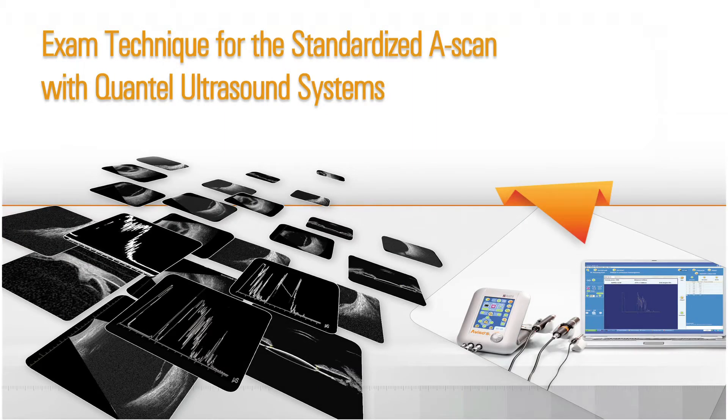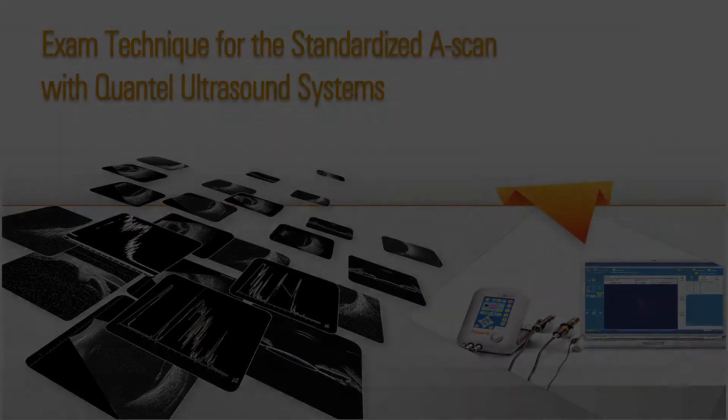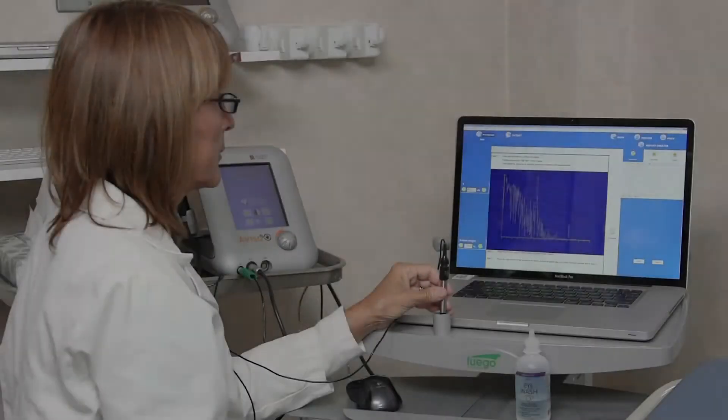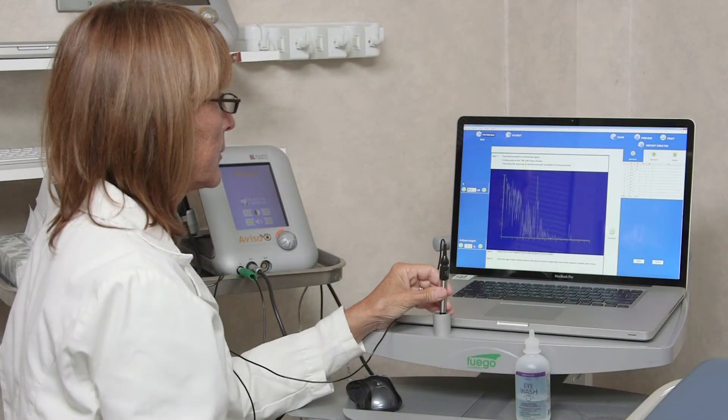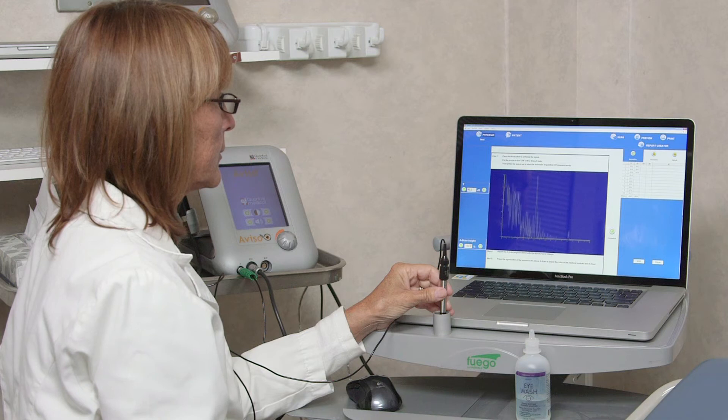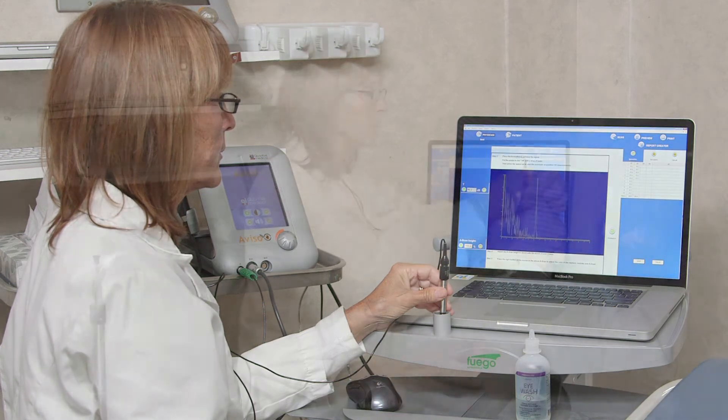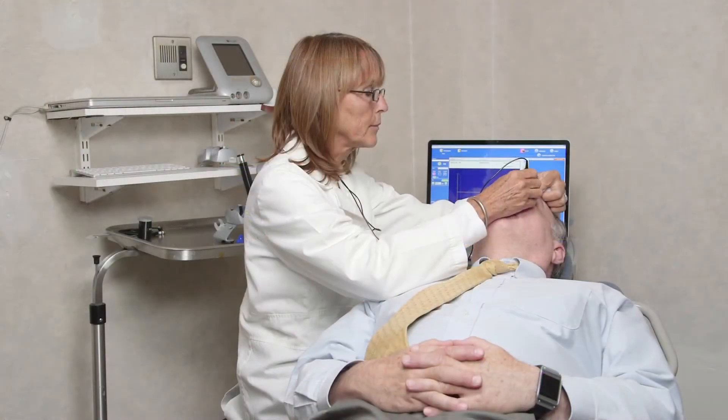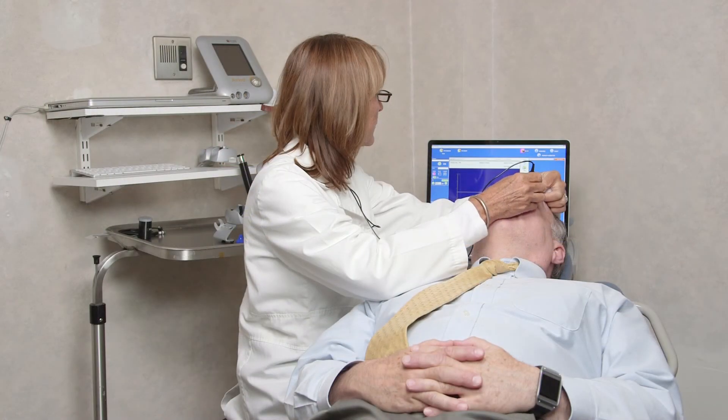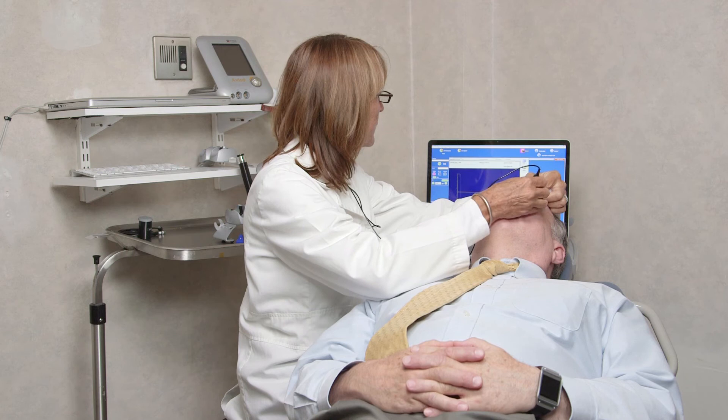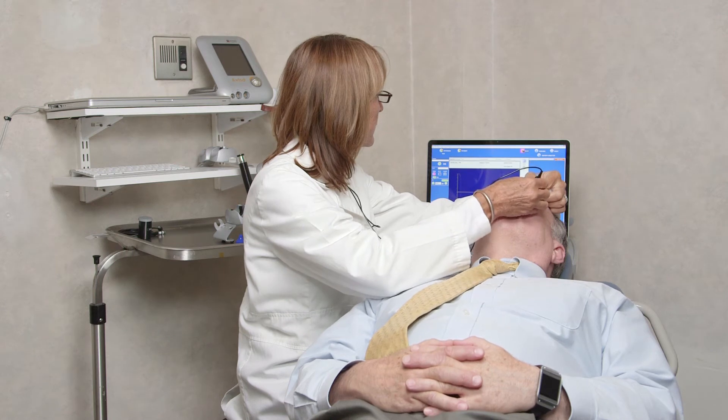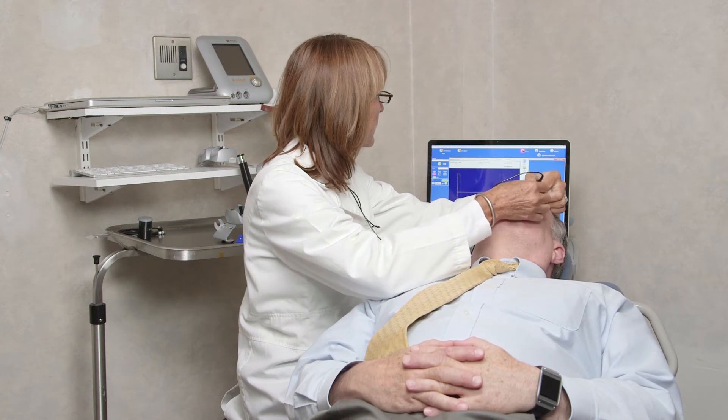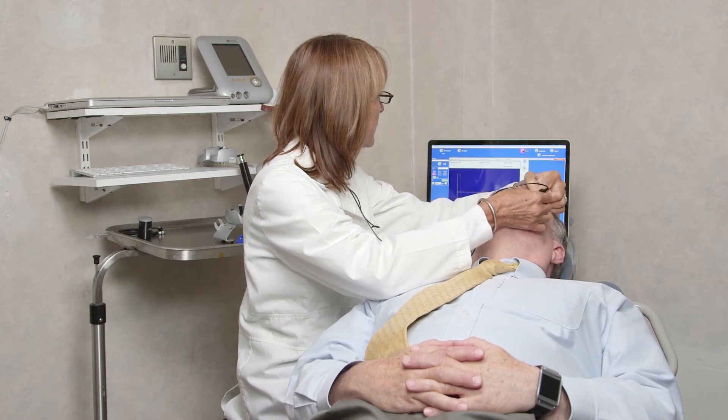Exam Technique for Standardized A-Scan with Quantel Ultrasound Systems. This video will review the fundamentals of standardized A-scans, discussing why and demonstrating how to perform them using the Aviso-S from Quantel Medical.